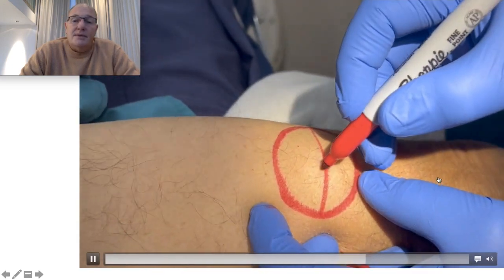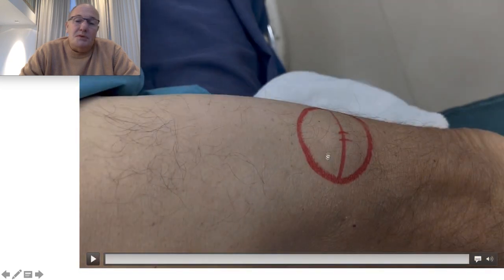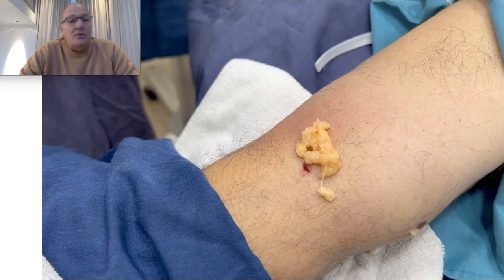I mark the kind of resection that can be performed with the conventional procedure, and this is the small incision with laser that I'm going to do to remove the lipoma. Here we can see the lipoma was removed through this small incision, which is not going to require stitches. This is an ambulatory procedure with local anesthesia and no complications.